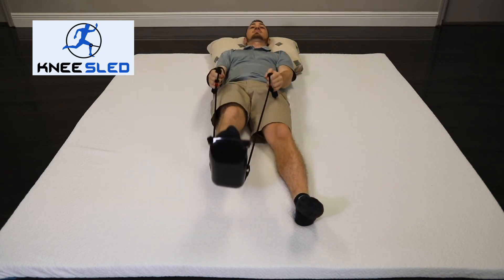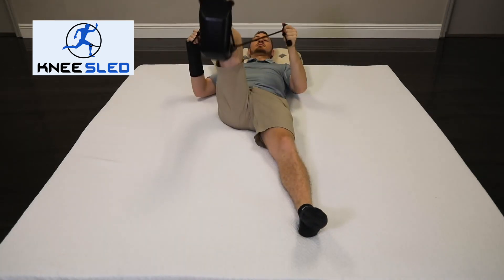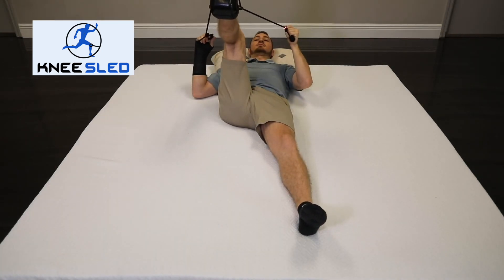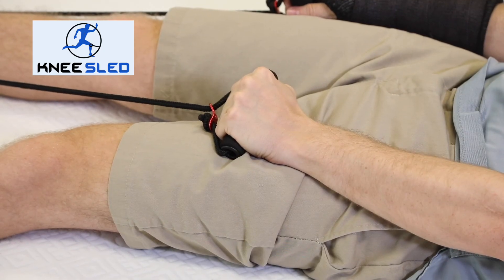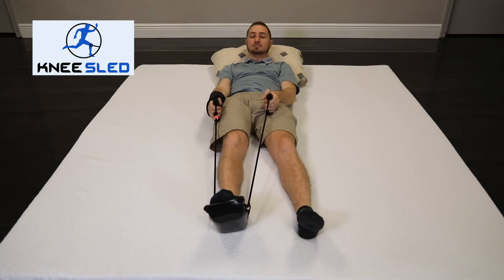Additionally, you can apply resistance strength training by holding the rope as you extend your leg. The better you feel, the more resistance you should keep applying, as this will allow your hip to get stronger in a safe manner.